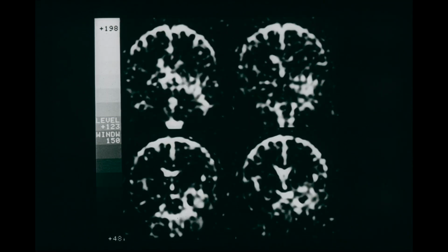Now, where it's thought this might be useful, it turns out that the sodium ion concentration is elevated by a factor of 2 or 3 in tumor cells versus normal cells. This is a left frontal lobe astrocytoma, which we see in the normal proton image, edema surrounding the tumor. In the sodium image, it's believed, right here, we're seeing elevated sodium ion concentration within the cells.